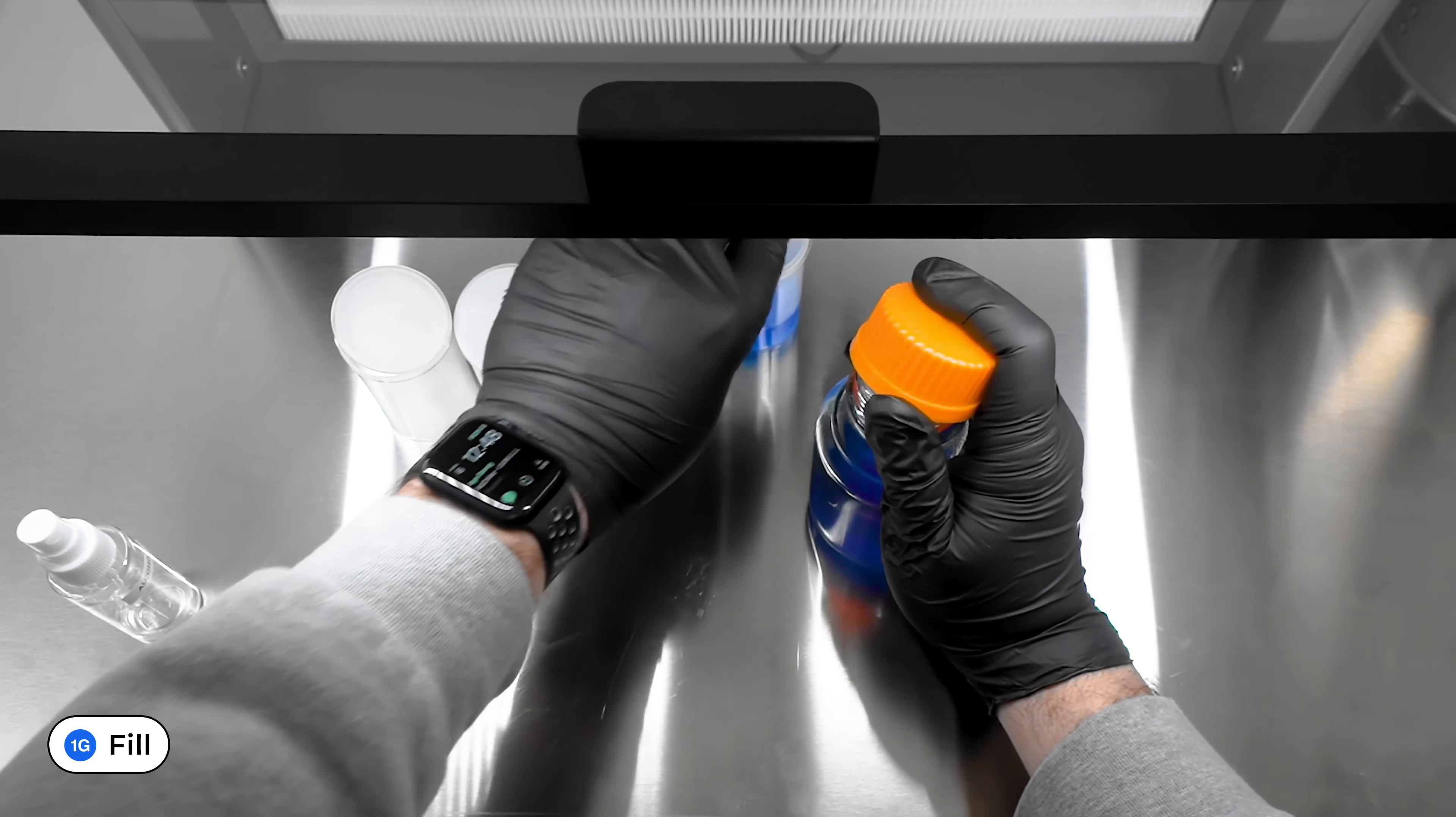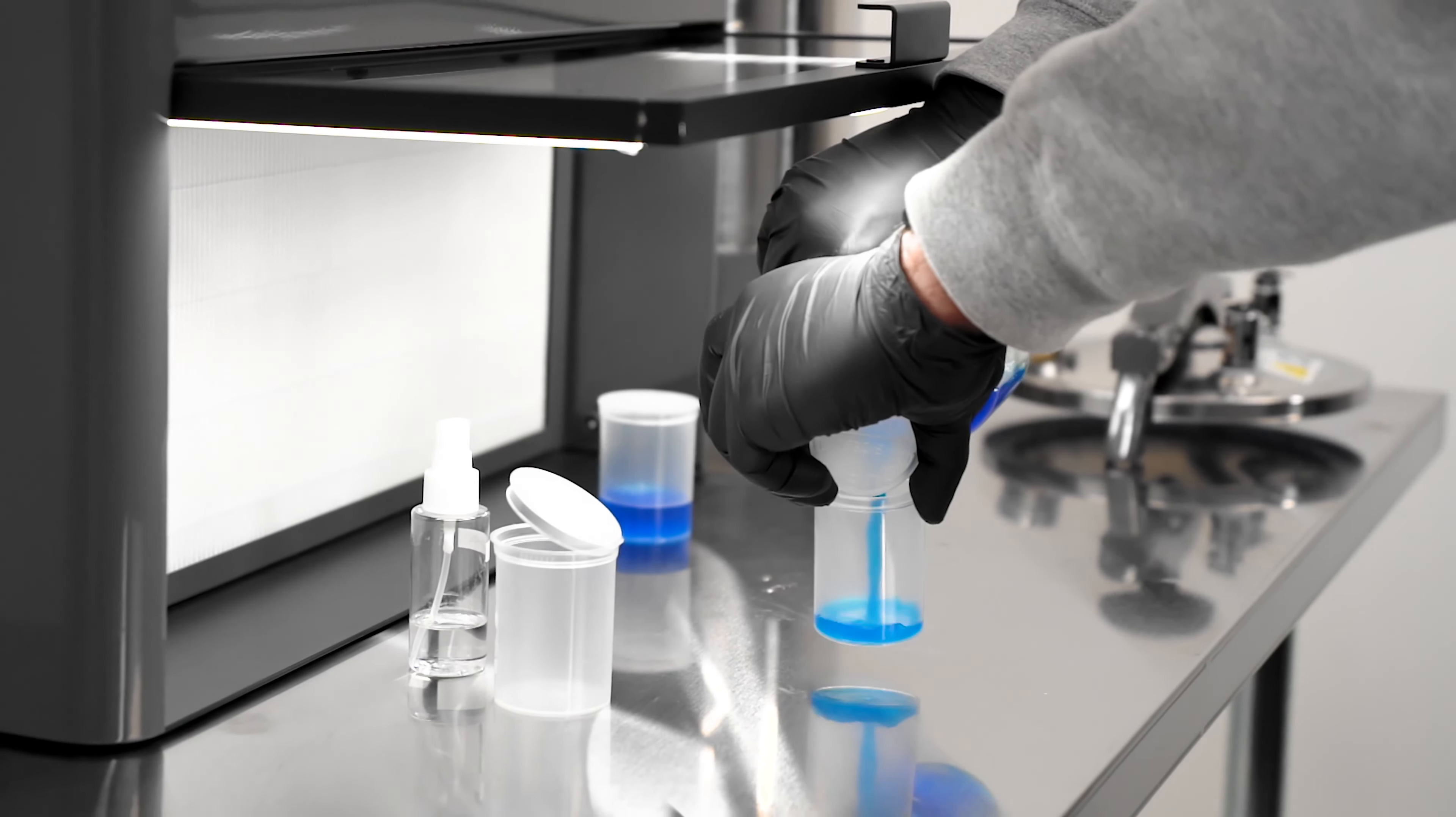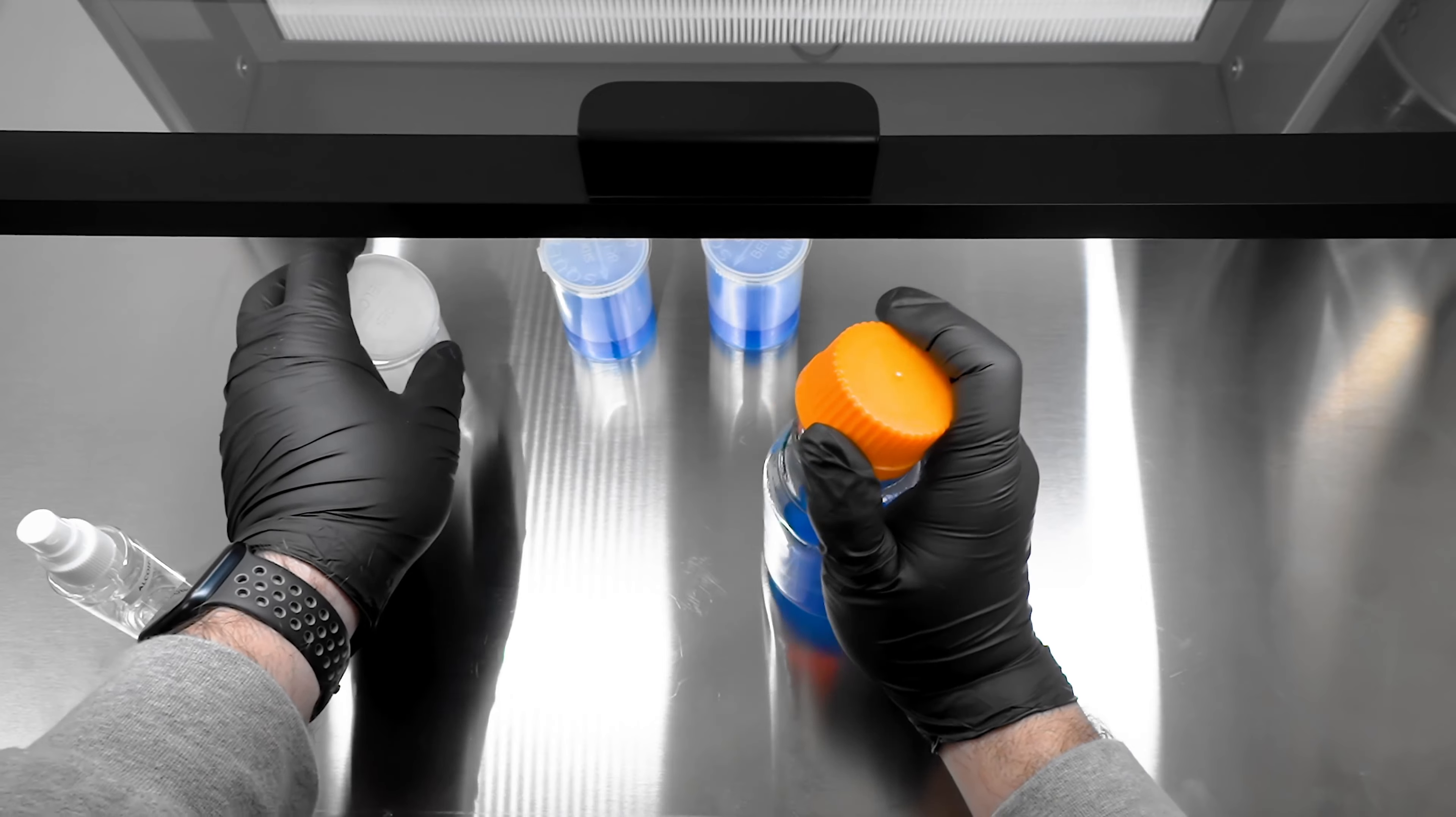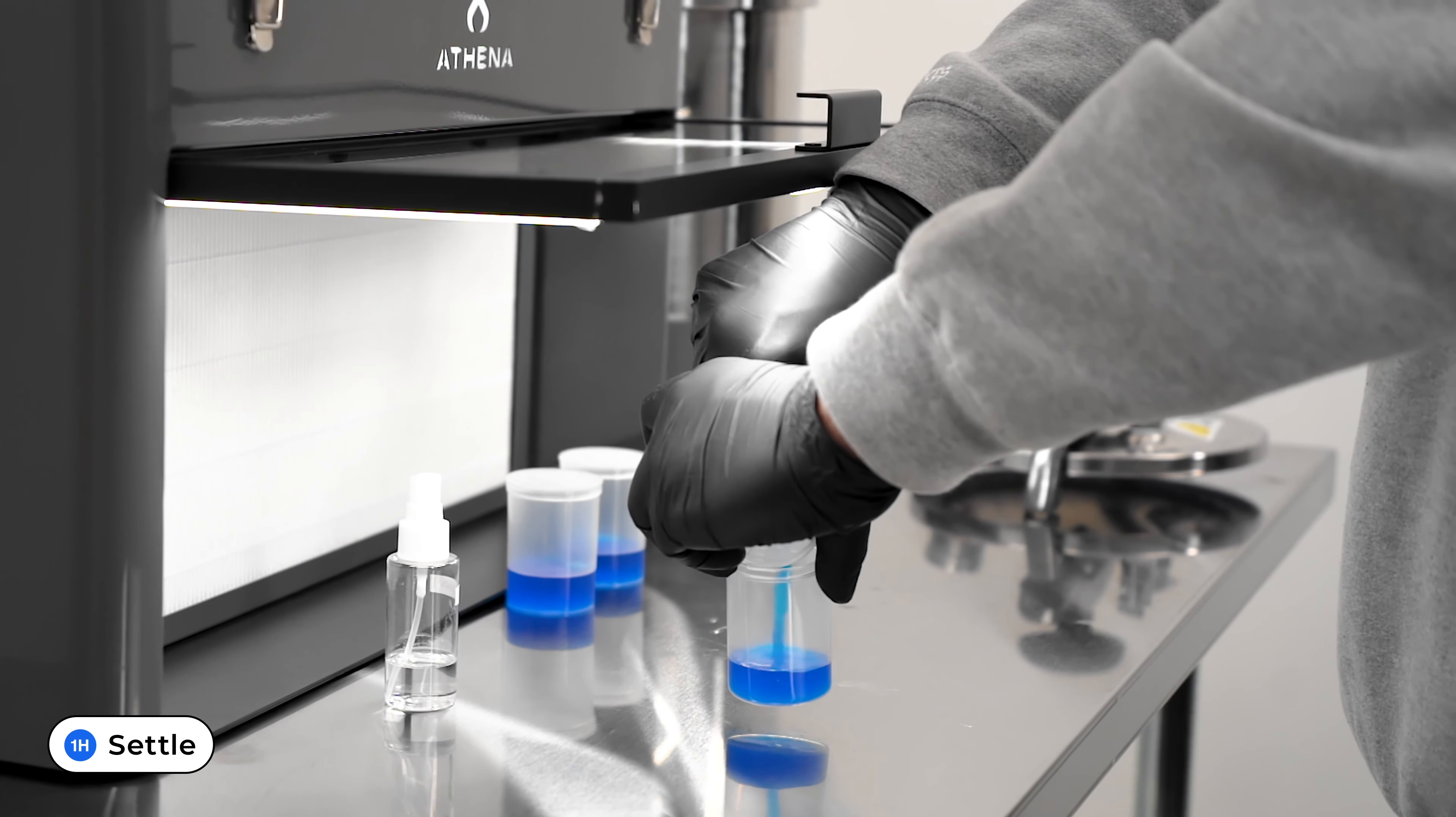Agitate the main media vessel before each pour into culture vessels to ensure equal amounts of solution in all culture vessels. Cap the culture vessels as soon as they are filled. Leave them to set alone until the media gel hardens.